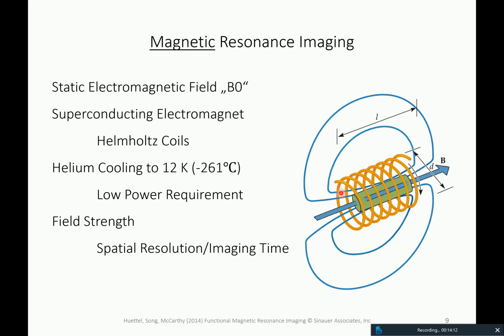So in terms of getting an intuition, these electromagnets are as strong as the electromagnets that you maybe have seen sometimes at a car graveyard, is that a word? Schrottplatz. That can lift cars essentially by using some magnets. So it's this kind of strength of magnetism that is involved here.